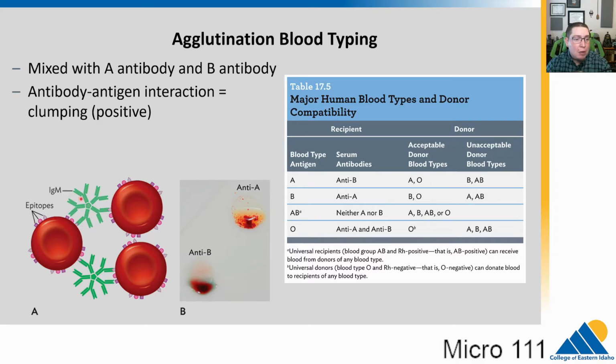The antibody molecule is binding to the A on the surface, and it did not do that in the anti-B test. So this would not be type B blood, and it's definitely not AB because there's no B reaction in here. So we can use it for rapid blood typing as well as identifying antibodies against microbes.